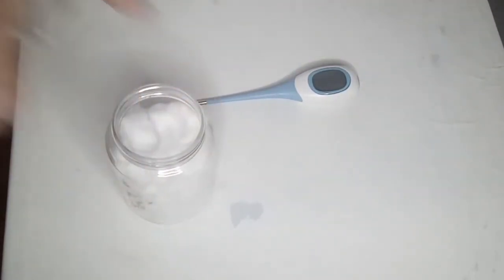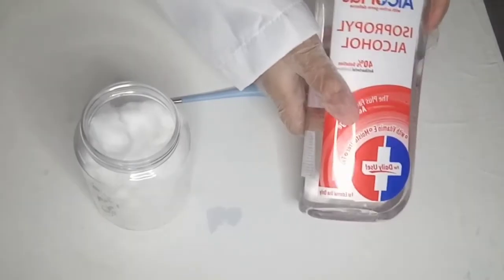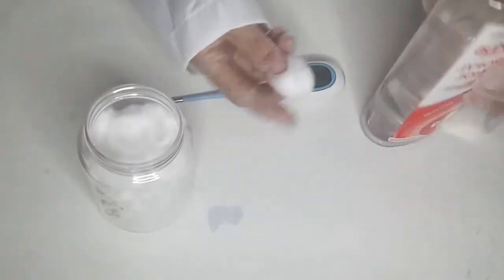Before using the thermometer, clean it first with a cotton ball and alcohol. Press the power button to activate the thermometer.